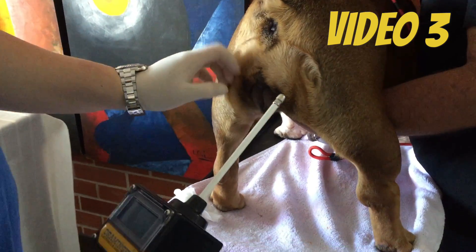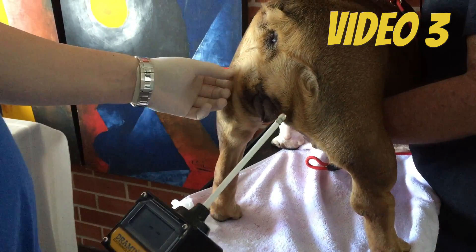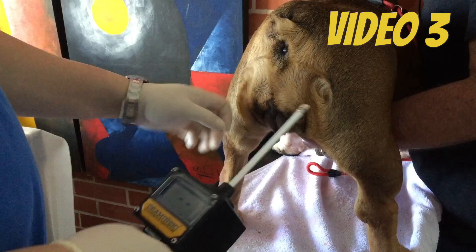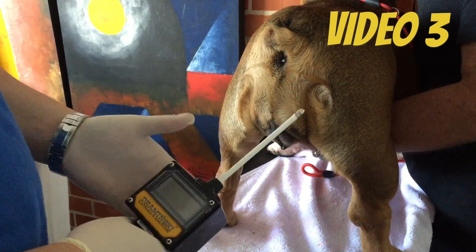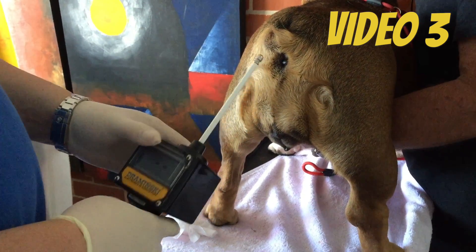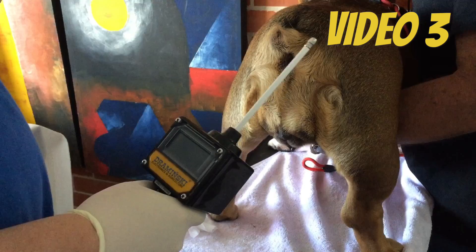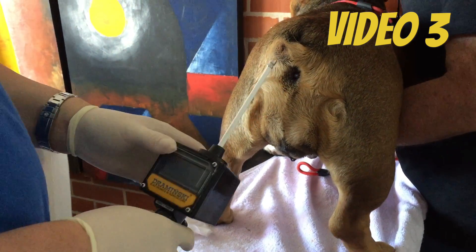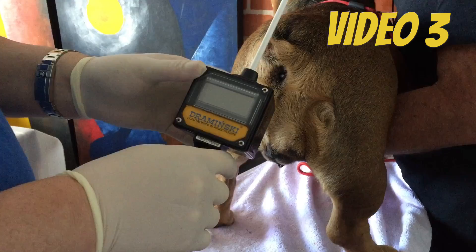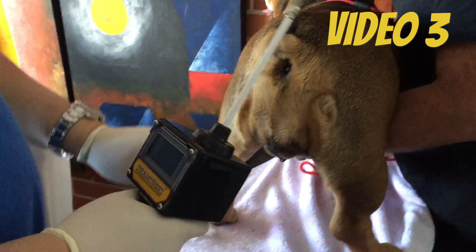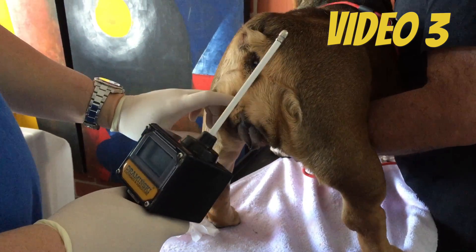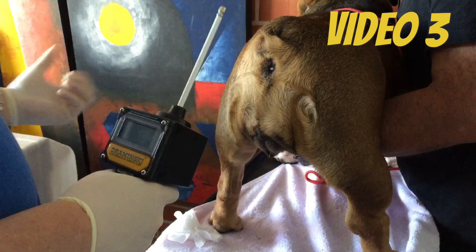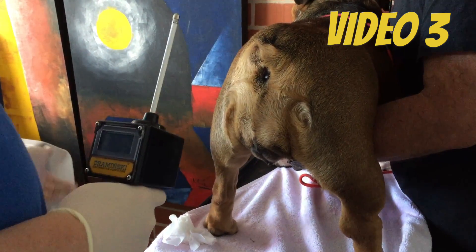Hello, good day to everyone. This is the third video that we've been documenting. We're checking three methods of which way is the best way to pinpoint the date to breed your female. We've been checking with the Draminsky ovulation detector, I've also been doing a vaginal smear, and I'm also checking progesterone levels.